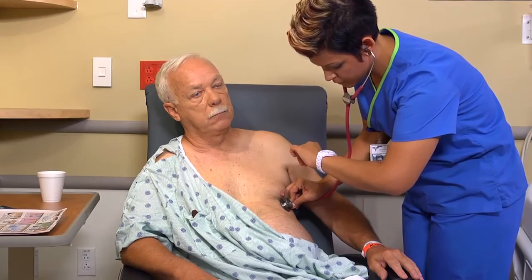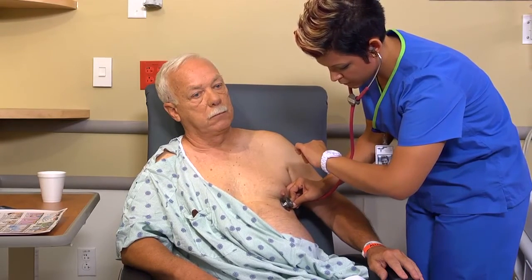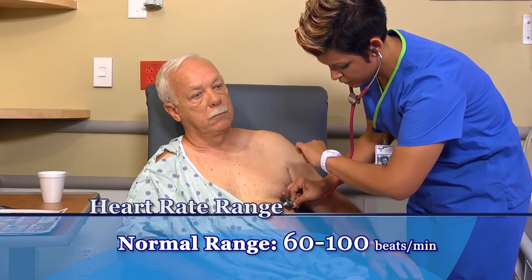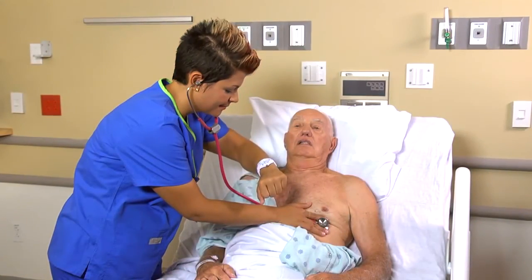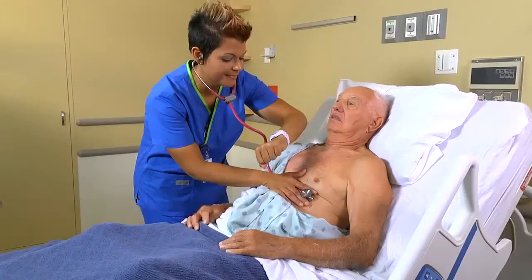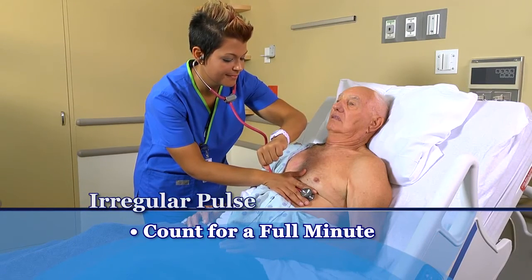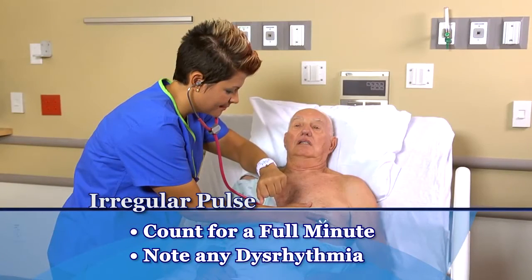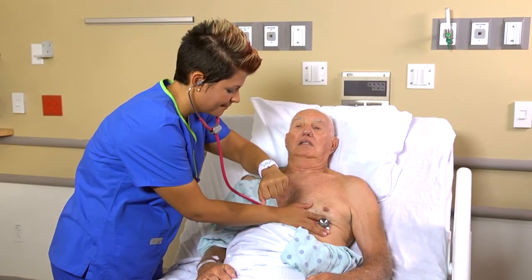If the pulse is regular, count the rate for 30 seconds and multiply the total by 2. A normal heart rate ranges from 60 to 100 beats per minute. If the pulse is irregular, or the patient takes a cardiovascular drug, count for a full 60 seconds. Also, listen for patterns of irregularity with any dysrhythmia — for example, you might notice that every third beat is skipped.